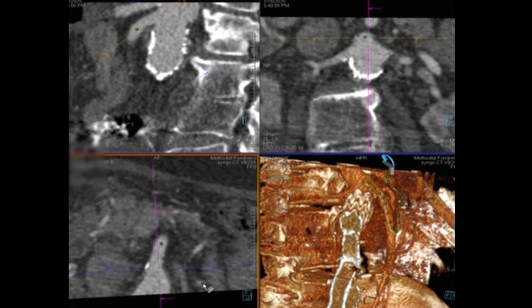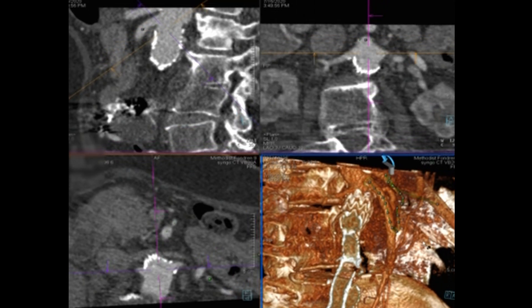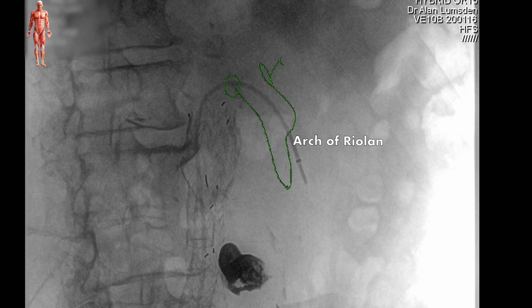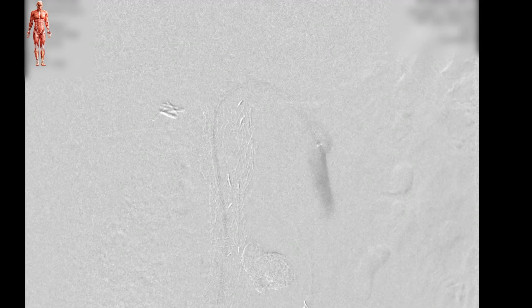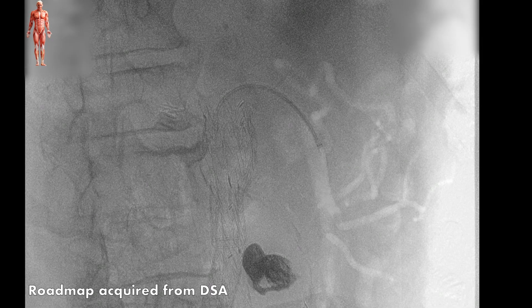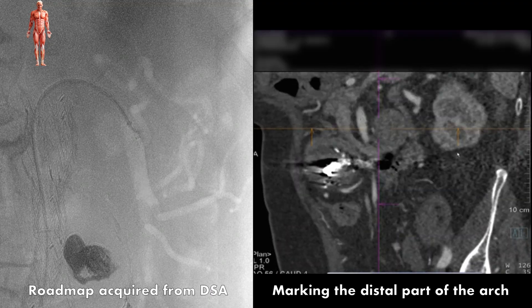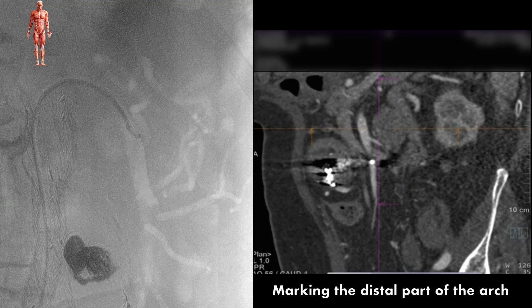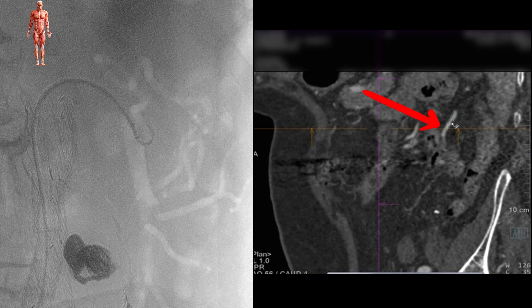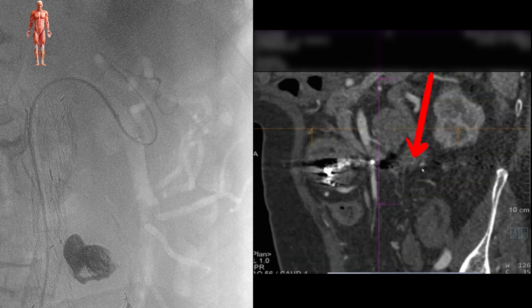Discrepancies between the actual vessel position and the preoperative imaging are mainly caused by the rigidness of the inserted endovascular devices; however, the overlay can be fine-tuned and adjusted manually. In this case, we chose to obtain a roadmap by performing an additional angiography to aid the cannulation of the small side branch leading us to the arch. During this manoeuvre, the distal part of the arch was marked using the same method.